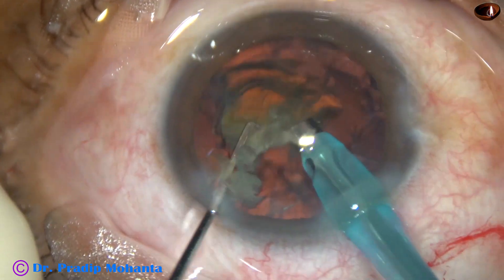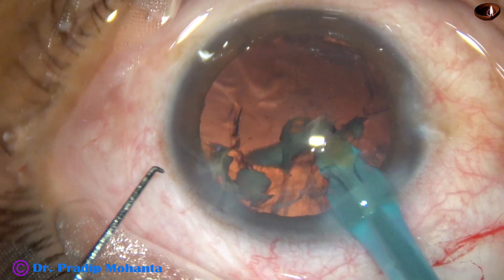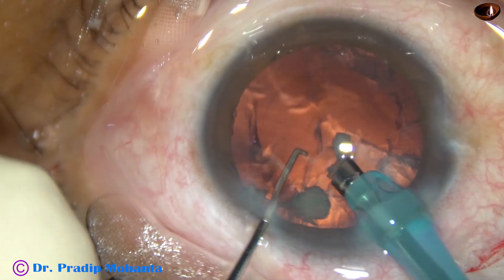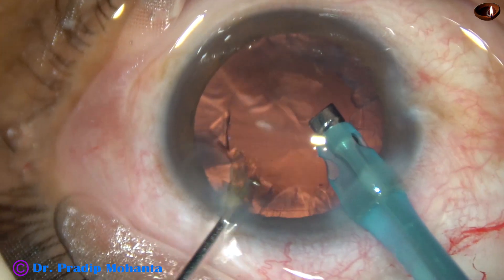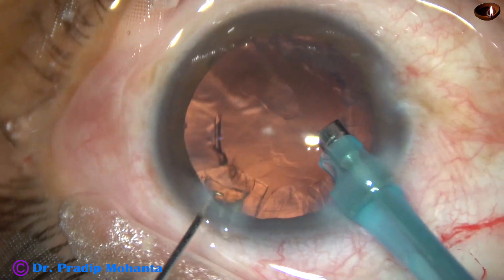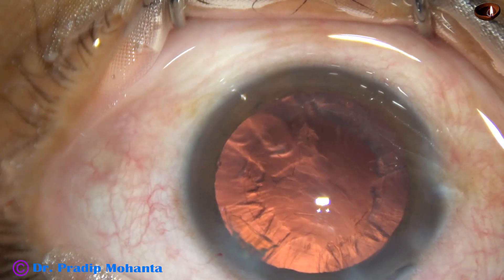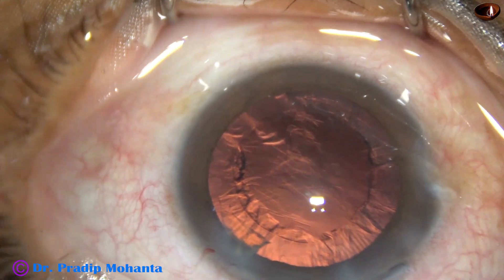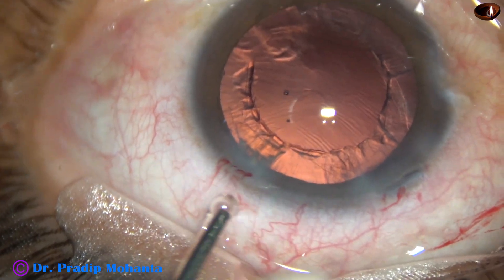This is the last piece; it is being emulsified. The nuclear fragments have been emulsified. The nucleus and epi-nucleus have been managed very nicely. 2% hydroxypropyl methyl cellulose is injected.